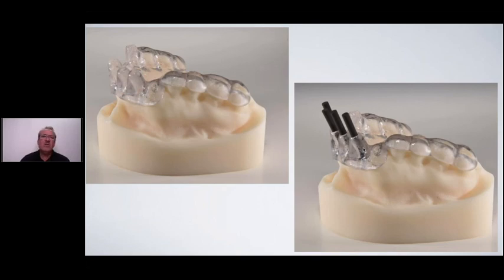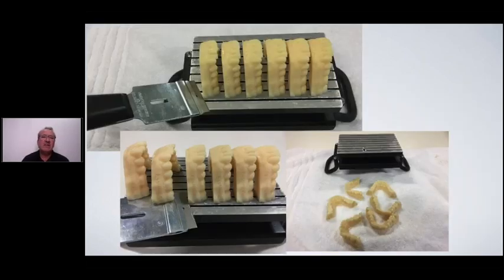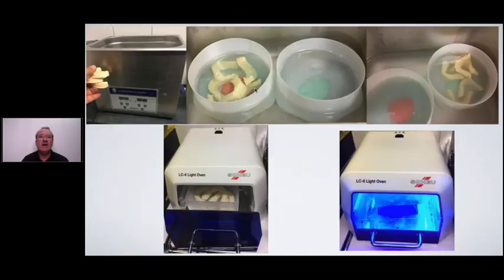So now how does it work? When you print your models, basically the models stick to a tray like you see here. So you have to take something like this and just swap them off the tray. So you just move them off the tray, put them in isopropanol alcohol like you see here, and then you clean it for about 4 minutes in the ultrasonic. After that, we put it back in a light curing oven. Nowadays, we are using a different type of oven from a company like NK, it's called Otto Flash, which has got also nitrogen.